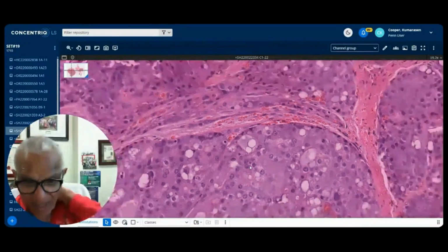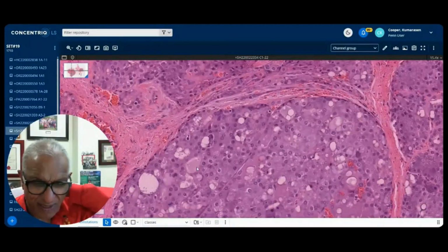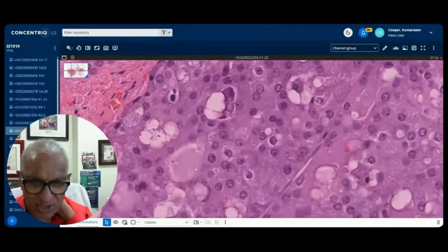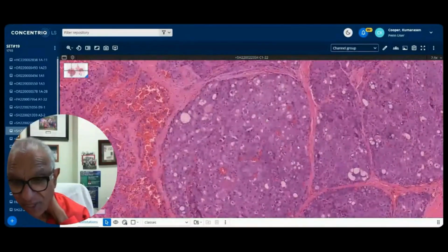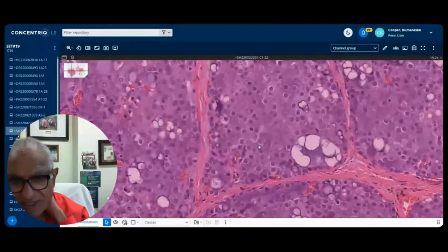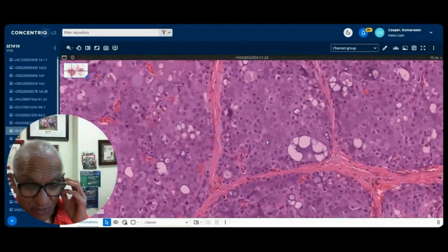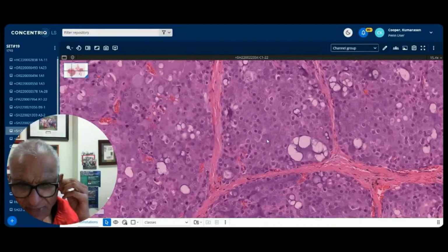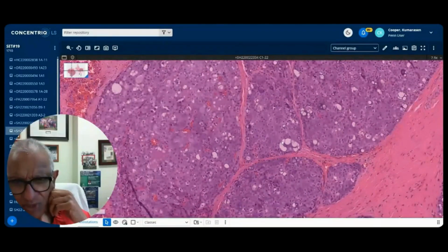So that would be it, and then of course you have these secretions and these vacuoles with pale eosinophilic secretions here as well, which I thought somebody might say secretory carcinoma, but nobody has said secretory carcinoma. That would be another differential as well. And then, of course, for mucoepidermoid, you'd want a mucin stain, as well as, if you have the privilege and luxury of MAML2 FISH, that would help. CRTC is the fusion partner, and MAML2 would be useful as well.